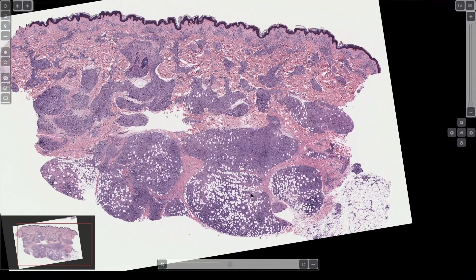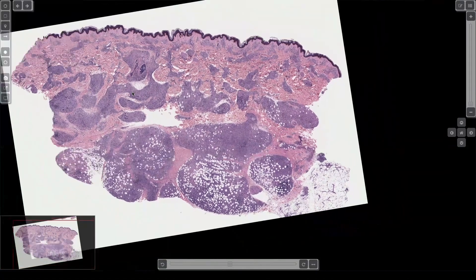Look at this — we have some sort of infiltrate all in the dermis and subcutis. It's very striking how it's organized into structures. How would you describe these? Yeah, there are nodules, and some of the nodules are kind of elongated — look at this one, it's almost serpiginous, like a snake or S-shape, an elongated linear kind of shape.